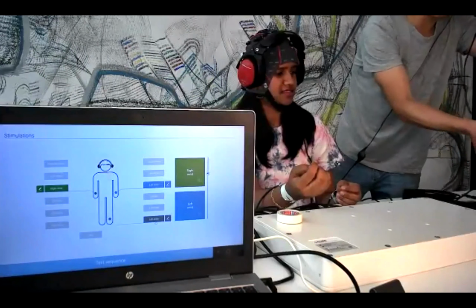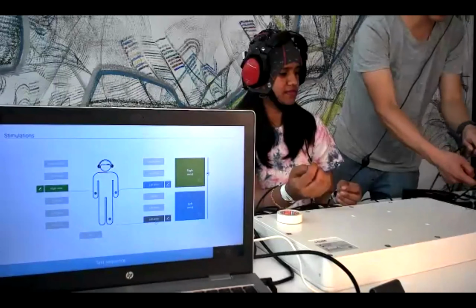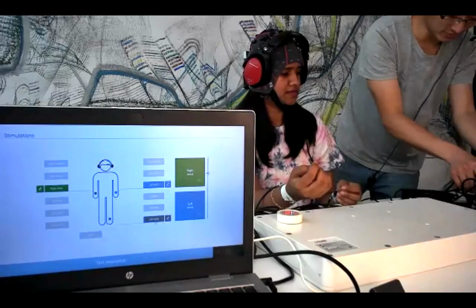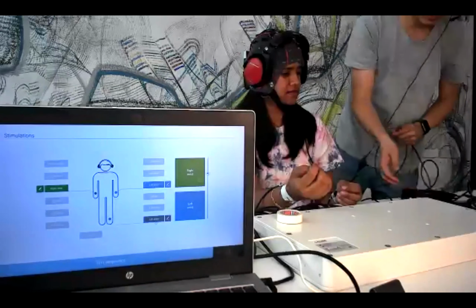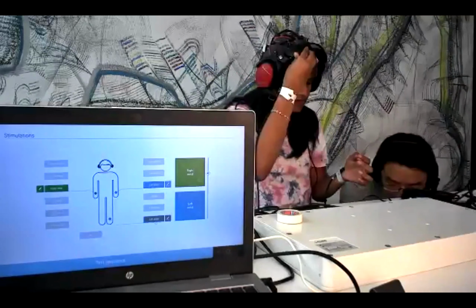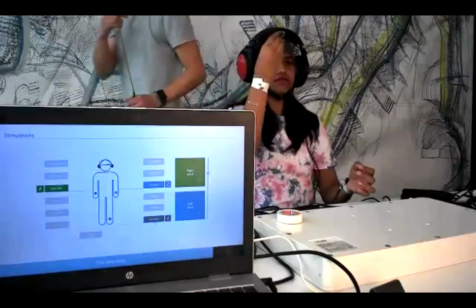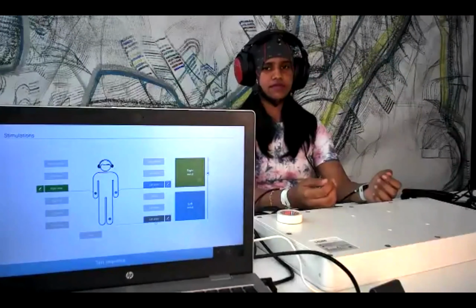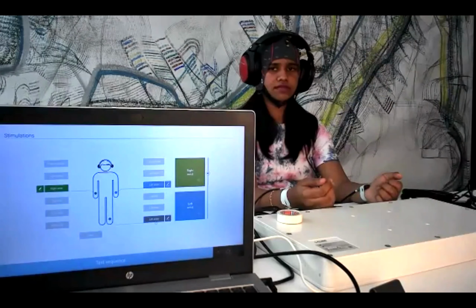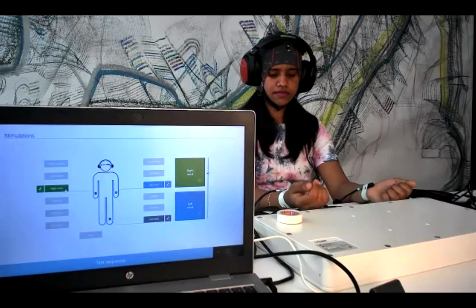So we have lots of tactiles here. As I mentioned before, we have 7 tactiles. I need to choose the correct one for the ankle for this structure. So I'm going to just put in the socket on the left ankle. Okay. I'll just try to confirm again. So the left ankle, left wrist, and right wrist.